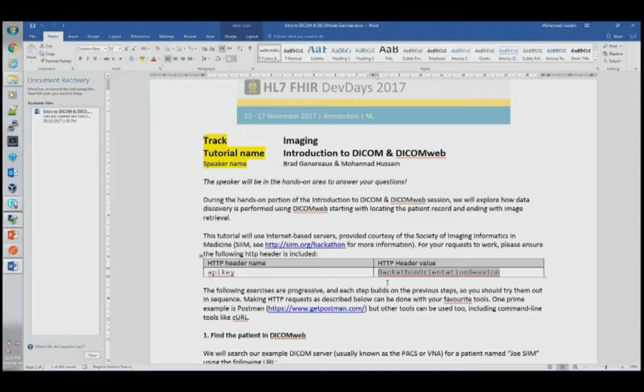I can walk you through the steps. For the purpose of this conference, we're going to use a generic key but that will be disabled by the end of the conference. So again, by the end of the conference, you'll want to get your own API key. You're more than welcome to step by. We'll show you how to do it. And the API keys are only used for analytics. They just do general analytics on how the servers are actually being used.